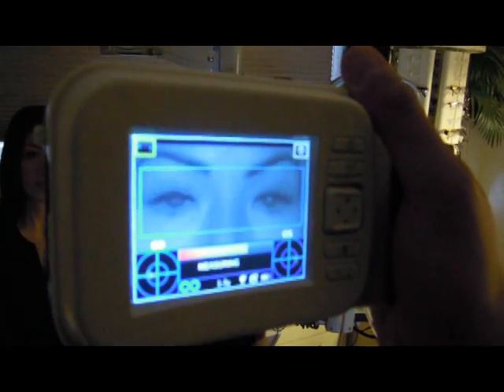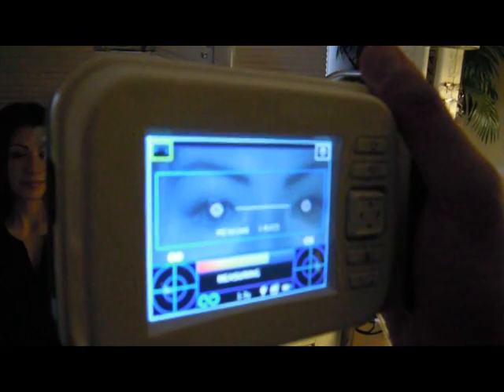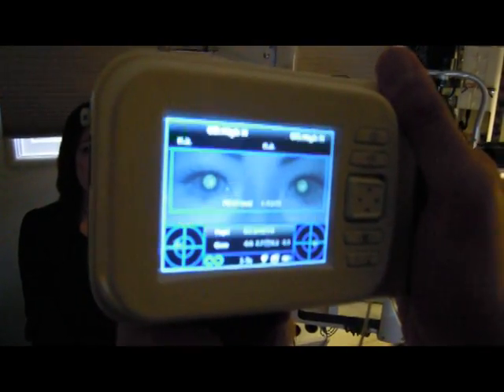During the measurement, please make sure that both eyes appear within the alignment window. If necessary, slightly tilt the 2-WIN so the line connecting the pupils is horizontal to the viewing window.